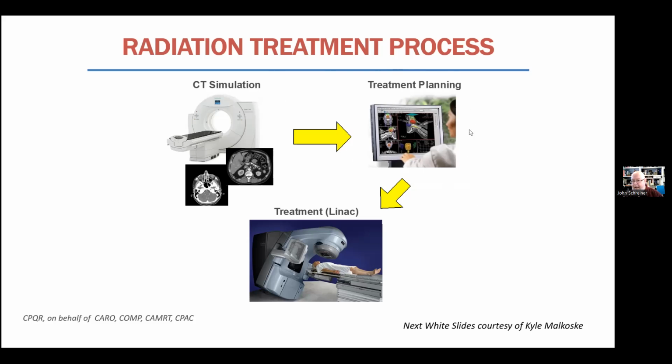This planning will generate control specifications for how the treatment machine should then deliver its radiation.